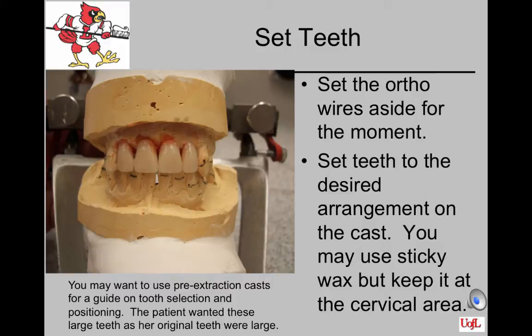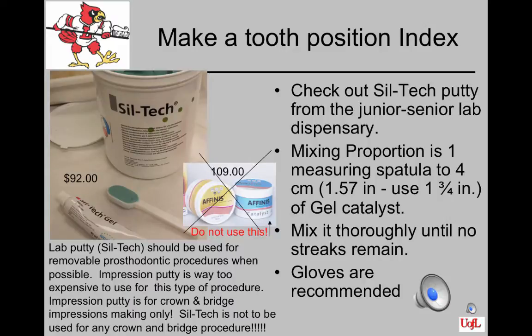Set the ortho wires aside and begin setting the selected teeth to the desired arrangement on the cast. You may need to cut on the ridge lap area of the tooth to get the desired angulation for maxillary anteriors. Use a slight amount of sticky wax limited to the cervical area — avoid getting it up onto the tooth as it's hard to clean off. Obtain the laboratory putty from the junior-senior lab dispensary rather than impression putty, which is extremely expensive for this procedure.